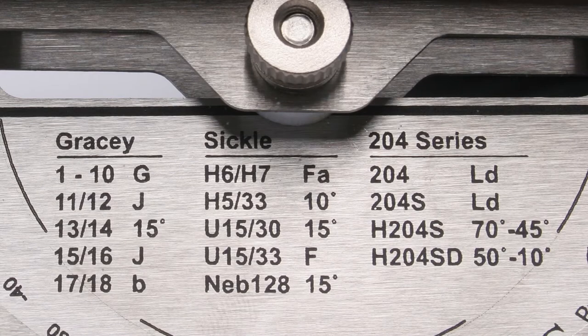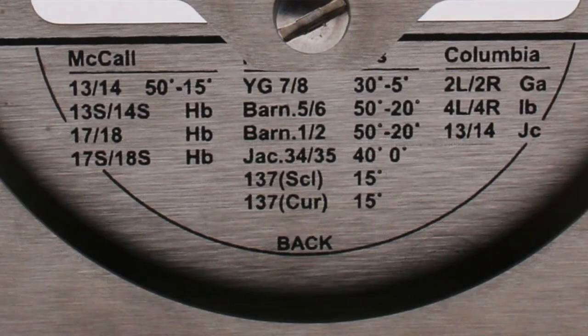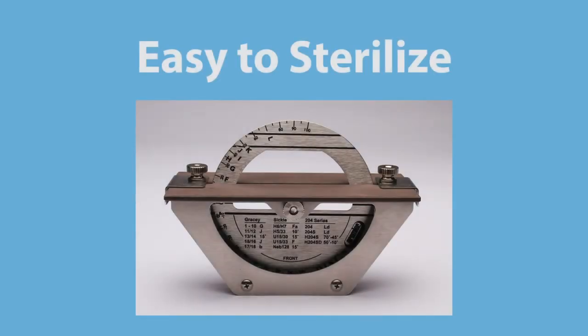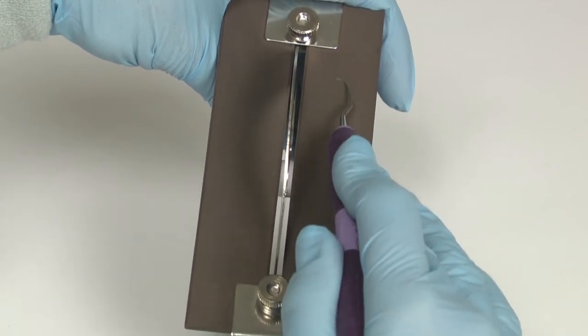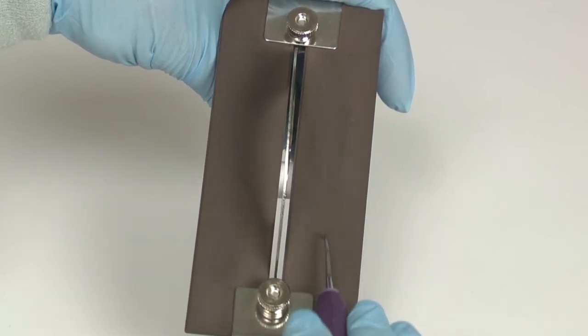The Premier disc sharpener eliminates the need to remember which angles are required for each instrument design. The guesswork is eliminated because the settings are clearly marked on the disc wheel. It is easy to sterilize. The ceramic stones are ideal for maintaining instruments daily and require no lubrication before use.